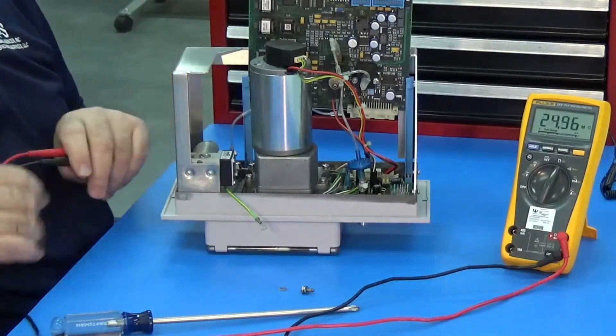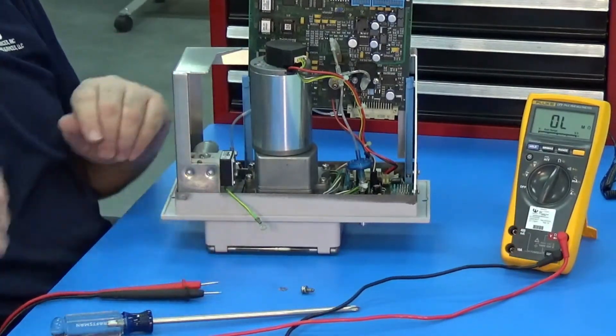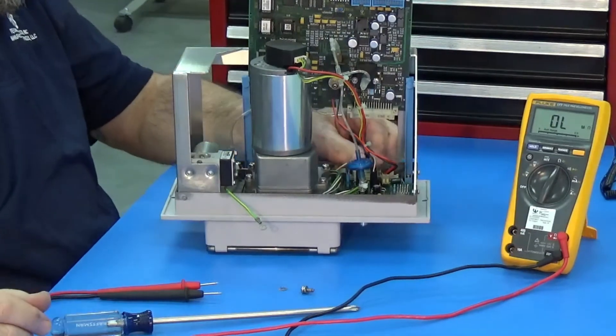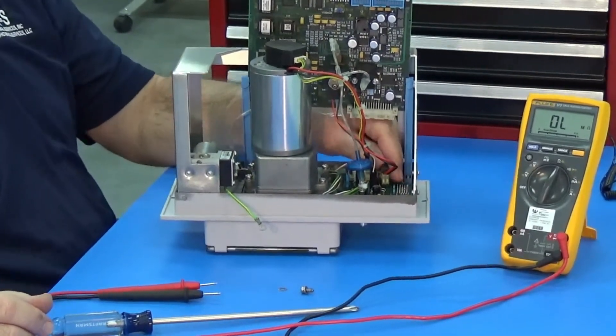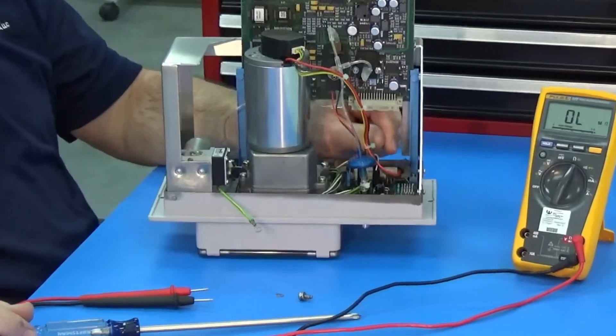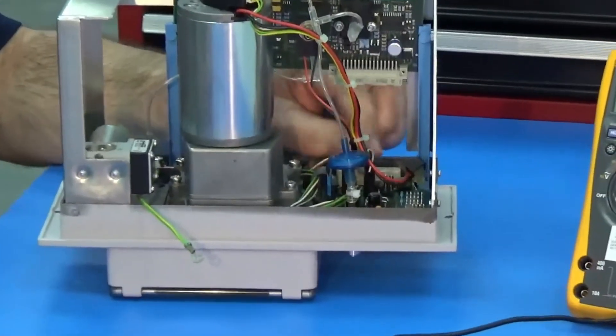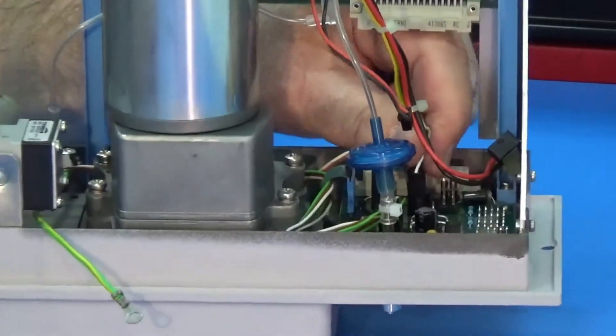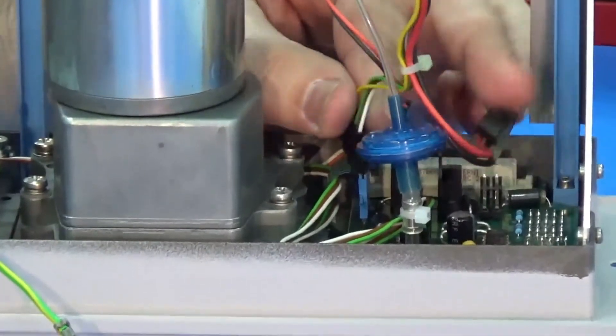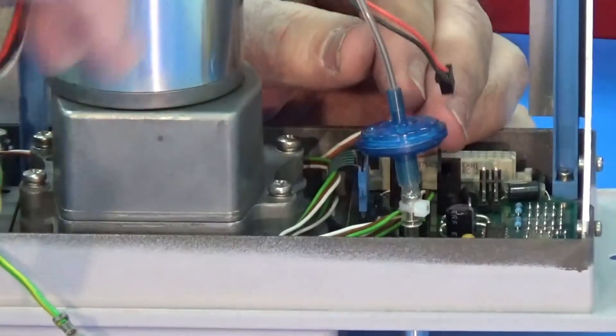Now we've got to remove, to measure the internal connections in the motor, we need to remove the motor cables. Pull the tab back and remove the optical cable. Take both of them out.